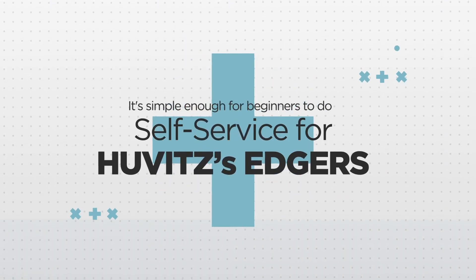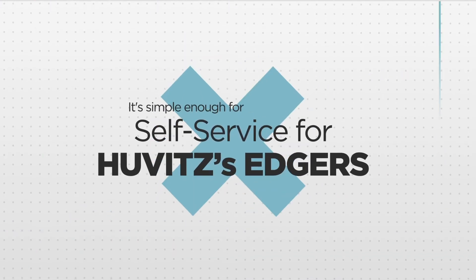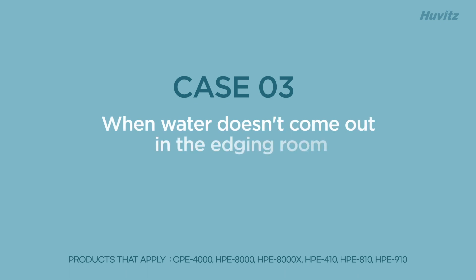Try to resolve the issue yourself before sending the Hubitz's edgers for after-sales service. If water isn't coming out of the edging room, here are a few things to check and try to resolve it quickly.